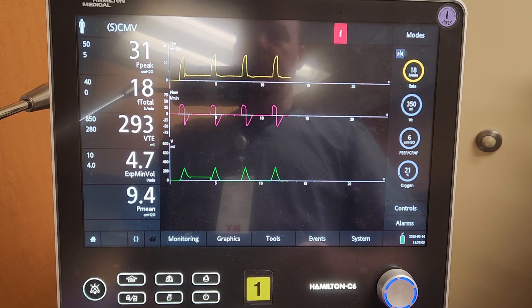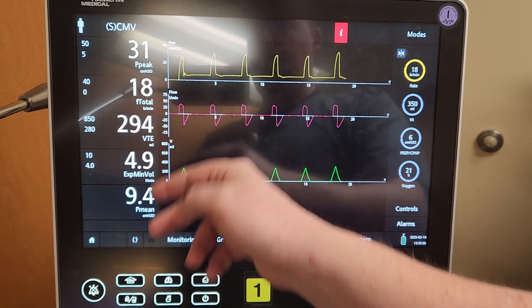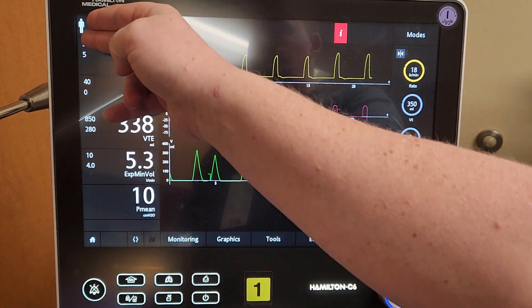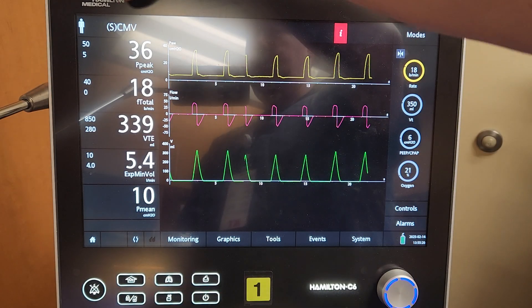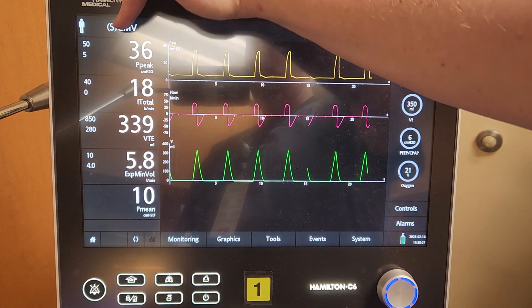Some of our important measurements are going to be peak inspiratory pressure, respiratory rate, tidal volume, and minute volume, along with mean airway pressure — all on the left-hand side. All of our currently set alarms are on the left-hand side as well. Up in the top left will be your actual mode, so when you're giving a report you'll see the mode right there.